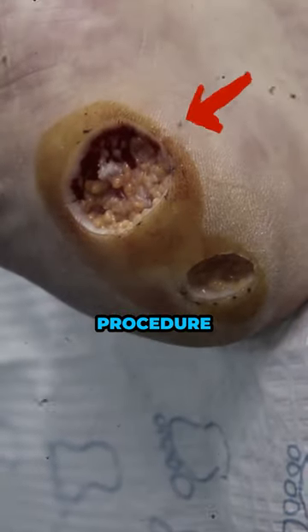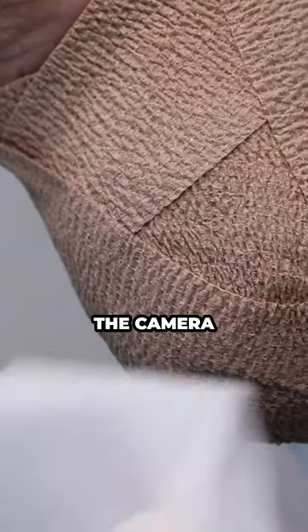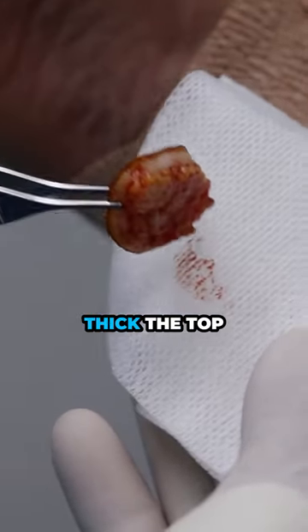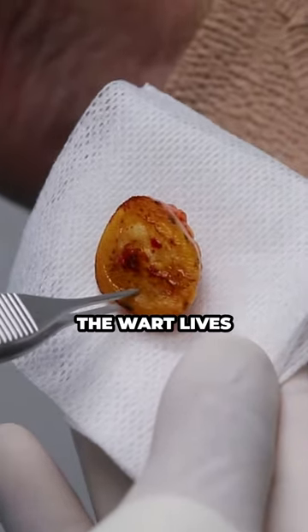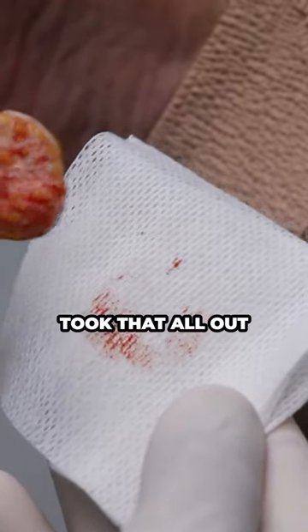That is really the whole procedure. Just to show the camera, we'll put it over here. It's really unbelievable to see how thick the top layer of skin is. Not much. And so the wart — four or five millimeters. The wart lives all within there, so we took very healthy borders. Took that all out.